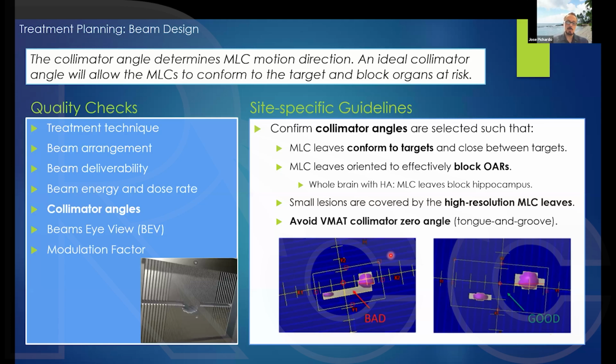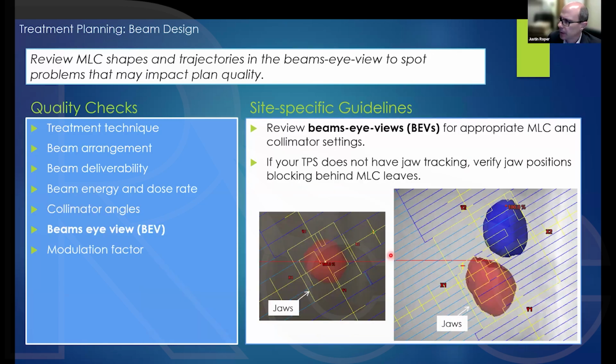So when you close the leaves completely, you still have a space where you can get transmission. So if you have areas again where you're overlapping those, then you're going to get areas with higher dose. So you're going to get hot areas, or you're going to get cold areas depending on whether you're blocking or you're adding. So that's usually when you look at the IMRT QA, you're going to know you have tongue and groove, because typically you get straight lines of cold points or hot points. That's usually how you know that you're experiencing tongue and groove. Probably not a very good explanation. Sorry. I think we can move on with the presentation.